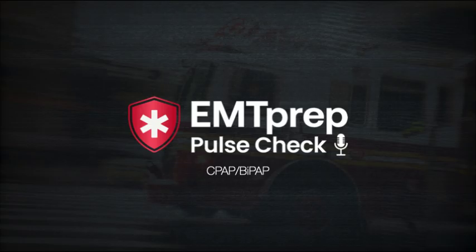How to apply CPAP? Well, first things first, as we are taught in school, apply PPE precautions and be scene safe. We're going to assist the patient into a high Fowler's position, and we'll assess vital signs: blood pressure, SpO2, respiratory rate, heart rate, end-tidal CO2 waveform capnography, and EKG if it's in your scope, as well as get a good set of lung sounds.